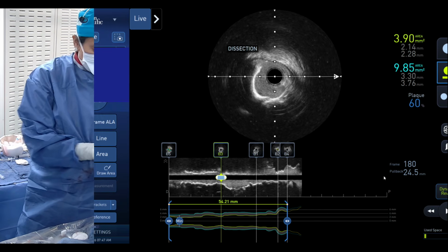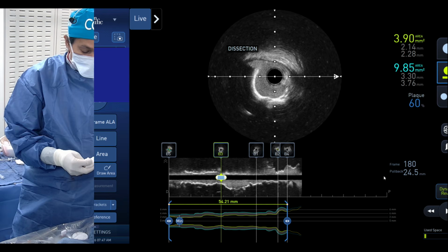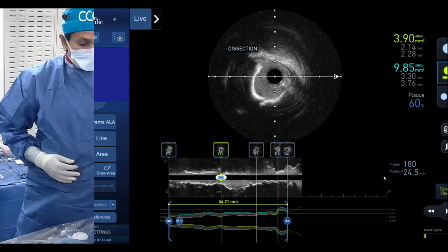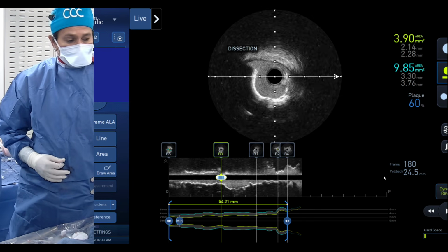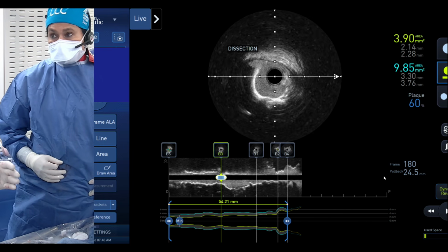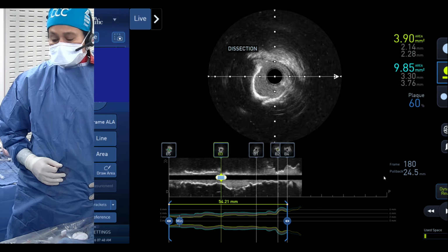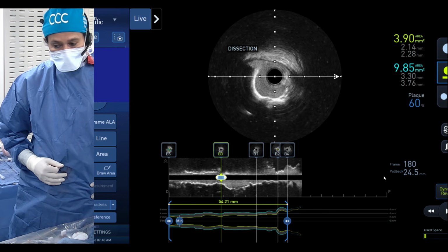That's really difficult to understand, but I think the study that we are doing, Nodule Shock, which we are almost more than halfway through, we should come up with some kind of an algorithm soon. Excellent. Nodule Shock will tell us, which people always ask, do you combine both techniques or is one good enough? And that is where there is a randomization of IVL with rota or IVL alone.